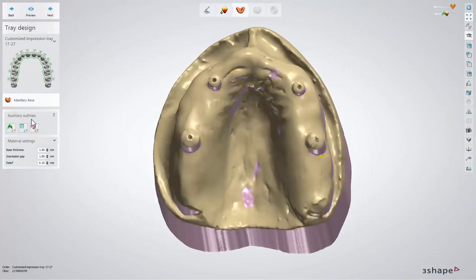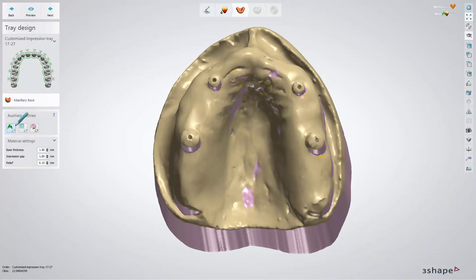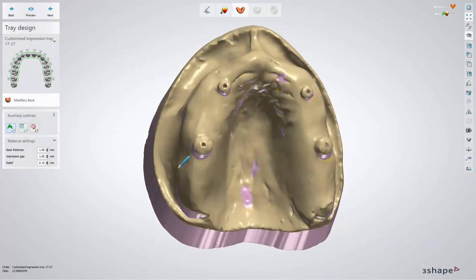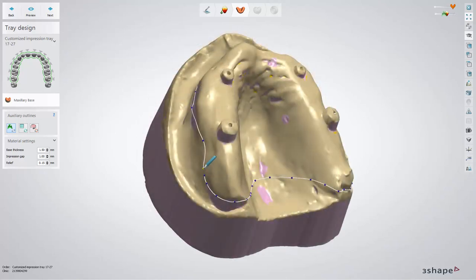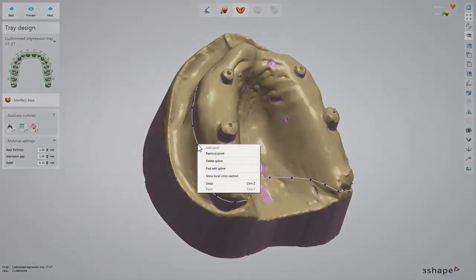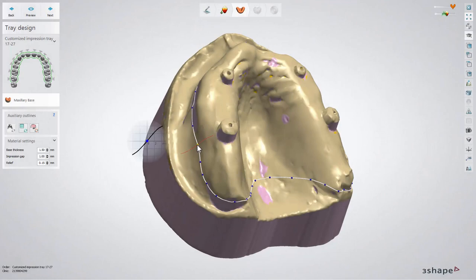To design the impression tray you need to place the spline to mark the tray's boundary. Make sure to place the border line 2-3mm shorter than the deepest point of the mucolabial fold. As soon as the border is finalized, right click on any blue point and activate the Show Local Cross Section. With this option you can easily control the spline over the border position.